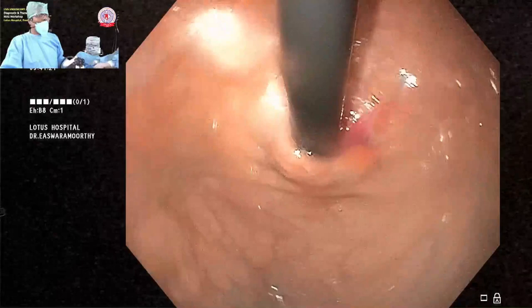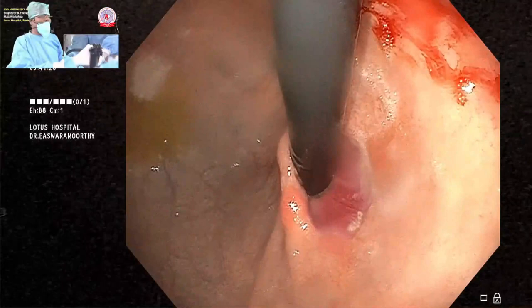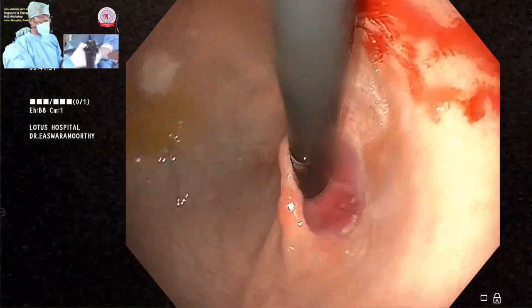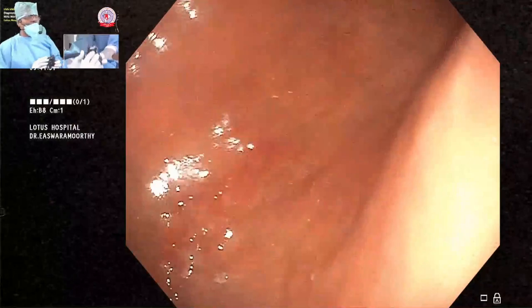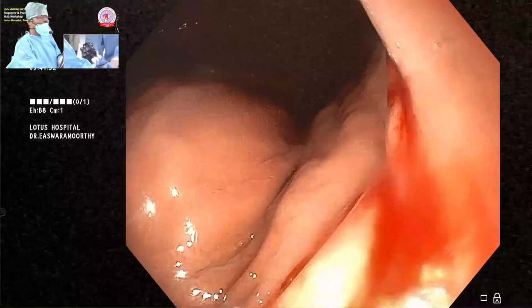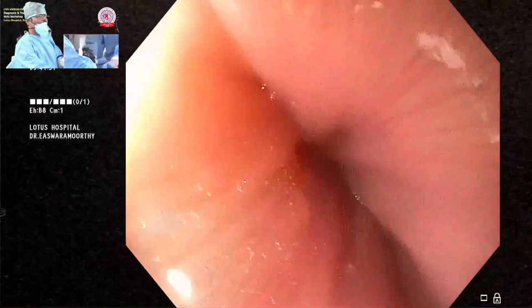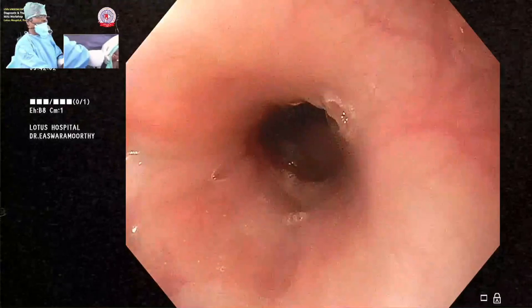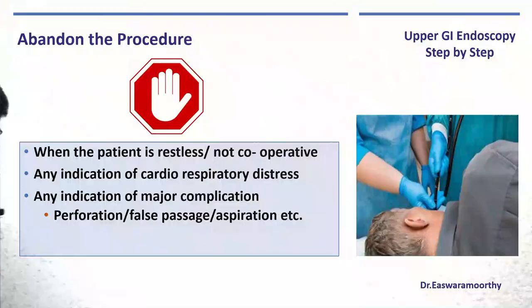In the retroflexed view, you can see the fundus, any fluid pooling, and cardiac pulsation close to the fundus. The cardia hugs the scope, the lesser curve is what is close to the scope, and the greater curve is away. Describe any lesion by its distance from the lesser curve, along the lesser curve, and proximity to the OG junction. The last step is to deflate — suction all air — then come out. The distensibility test can help exclude linitis plastica. See the OG junction clearly on the way out, then withdraw with full control, millimeter by millimeter.